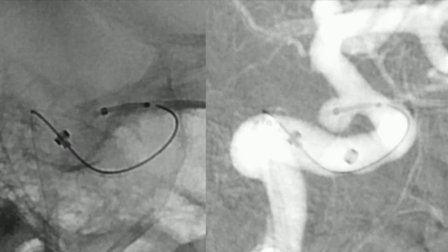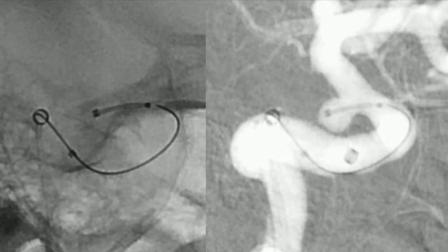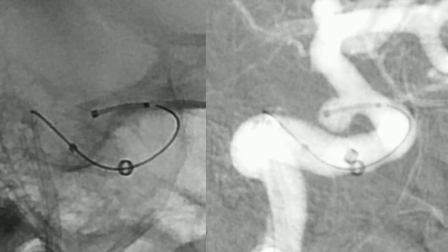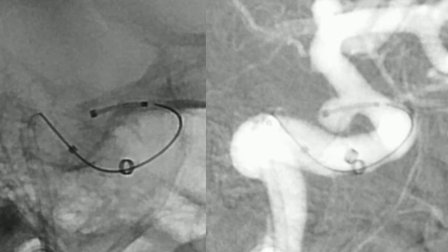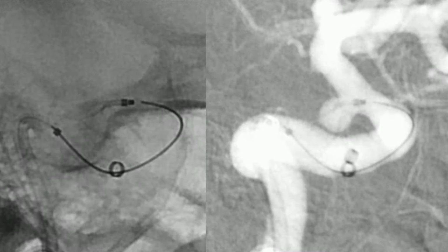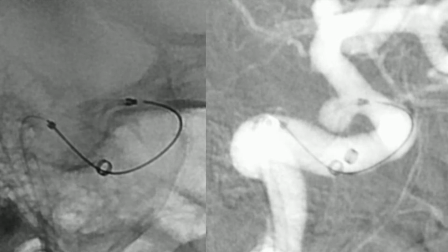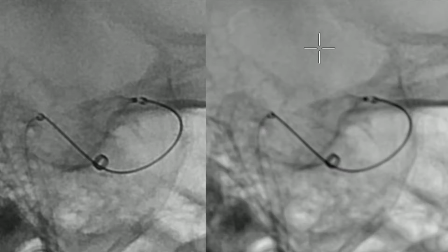And now we push the microcatheter tip until the wall of the dome of the aneurysm and try to implant it again. And now we repeat our maneuver, pull back the microcatheter and push the contour device, but as you can see, it does not open completely. And we can see that the contour device is a little bit prolapsed into the lumen of the vessel.